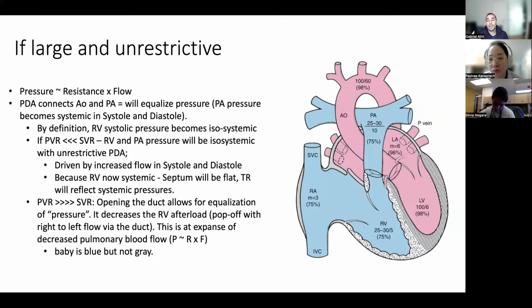So then you need to figure out, is the left atrial pressure high because the LV end-diastolic pressure is high, or because there's something between the LA and the LV? What could these things be? It could be mitral stenosis, blocking the way. It could be severe mitral regurgitation, or a mass in the left atrium causing blockage of the inflow of the LV, like a myxoma, which is rare in the pediatric or newborn population. So if you have high LA but normal LV end-diastolic pressure, you have to think about the LA diseases I just mentioned.